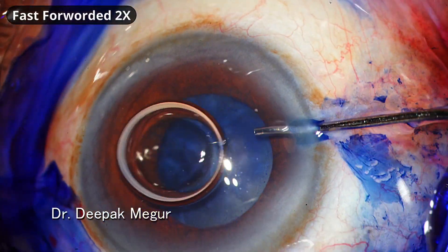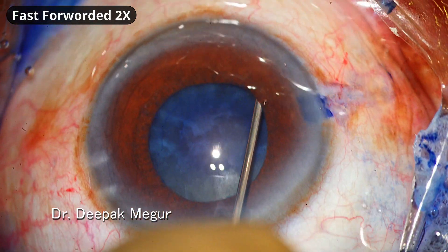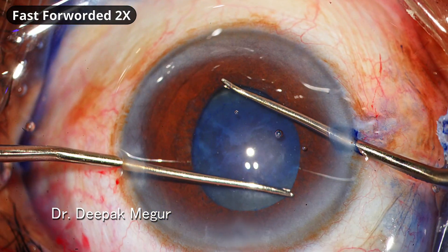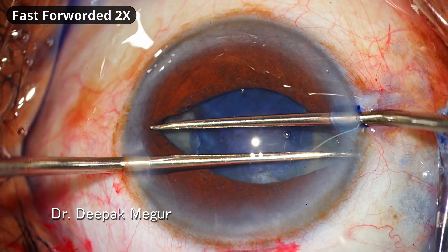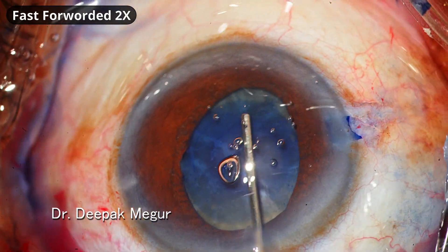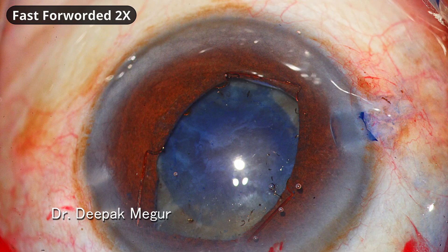At this point I'm not sure about the health of the zonules. Although we can perform phaco emulsification of this cataract with this sized pupil, since I was not sure about the zonule health I decided to stretch the pupil and use a BHEX ring for maintaining the pupillary dilatation, which would help me to deal with any intraoperative capsule-zonular issues if and when they arise.